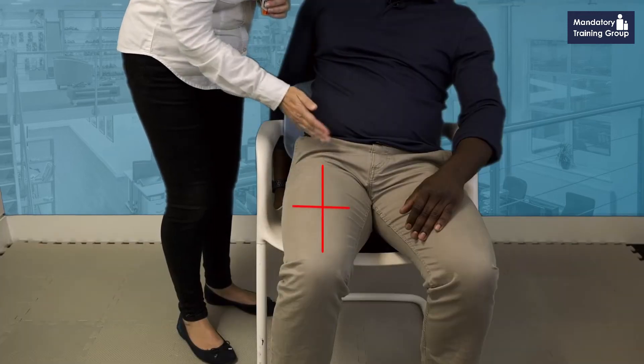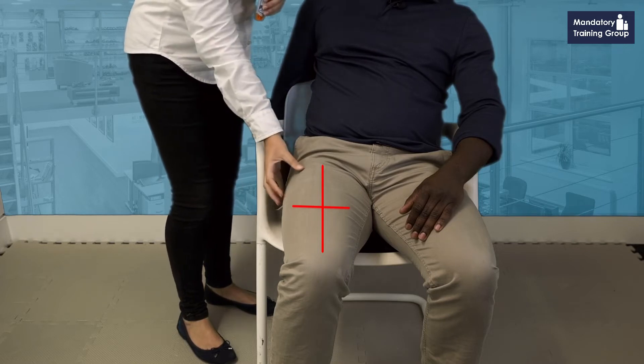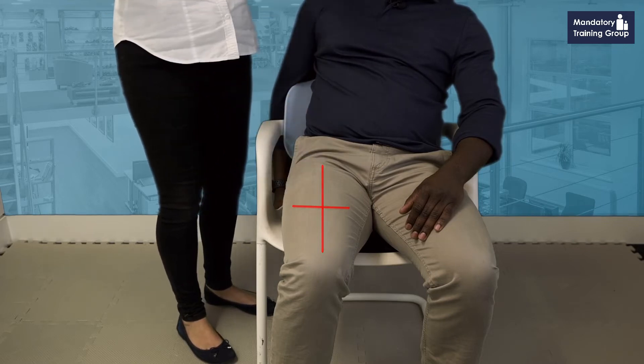You want to make a visual cross for yourself on your casualty's thigh — kind of like a visual cross. You stab the EpiPen into the upper outer side.